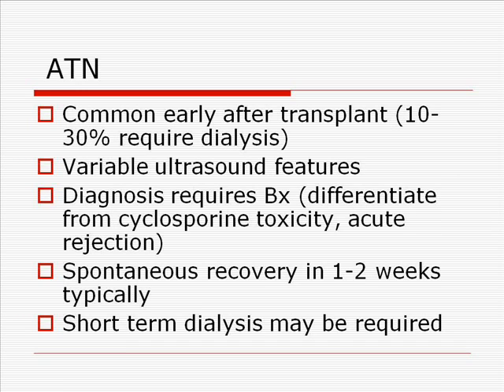ATN is present in most of the cadaveric kidneys, but it resolves spontaneously over the first 2 weeks, and ATN is more rare in living-related donors. Delayed graft function is usually related to the degree of warm ischemic time. Radionuclide imaging shows a delayed transit with delayed time to the maximum activity, a high 20 to 3 minute ratio, and marked parenchymal retention on sequential images. Recovery in ATN patients on hemodialysis will occur within 1 to 2 weeks, but can be delayed up to 3 months.